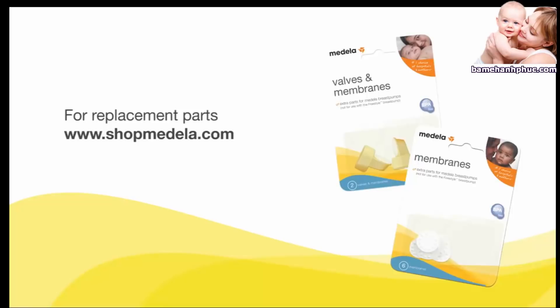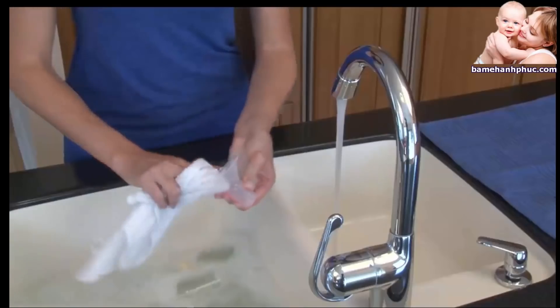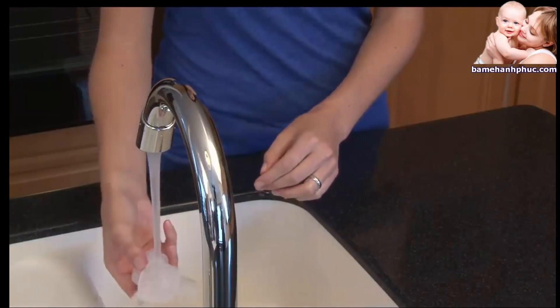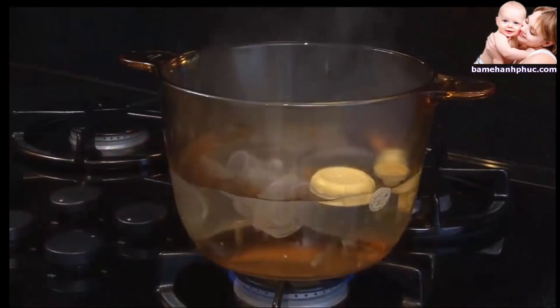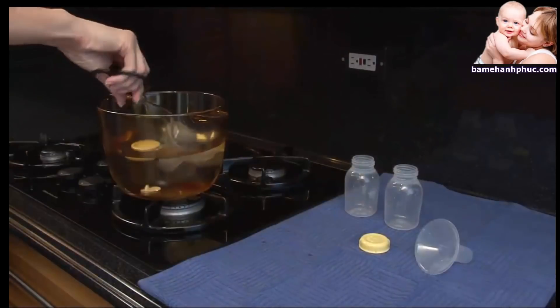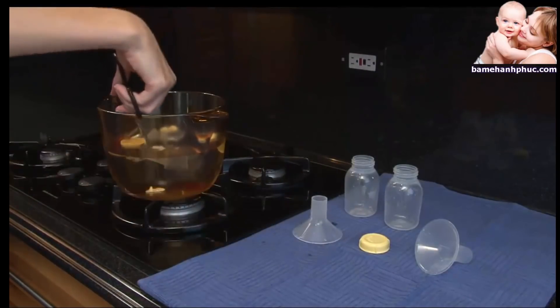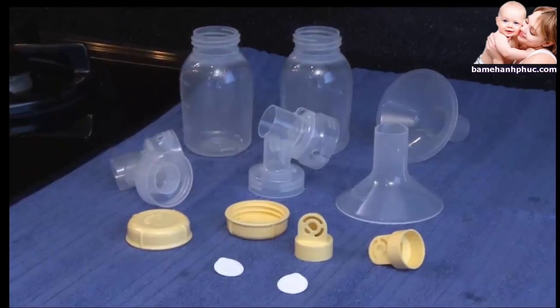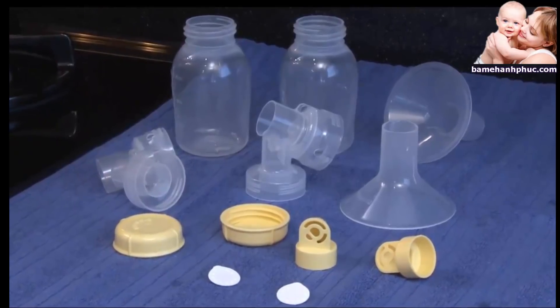If you notice any damage, replace the parts immediately. Rinse all parts in warm water, hand wash with warm soapy water, and rinse with cold clear water. Then sanitize by placing parts in boiling water and boiling for 10 minutes. Allow the water to cool and gently remove parts with tongs. Place the parts on a clean surface or towel to air dry. Store dry parts when not in use, and do not store wet or damp parts.